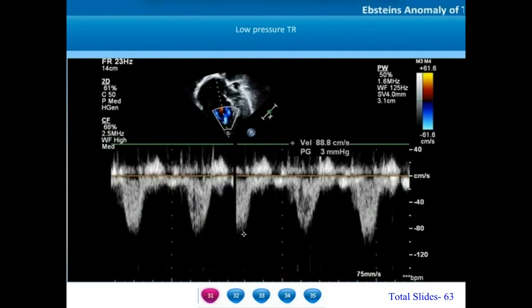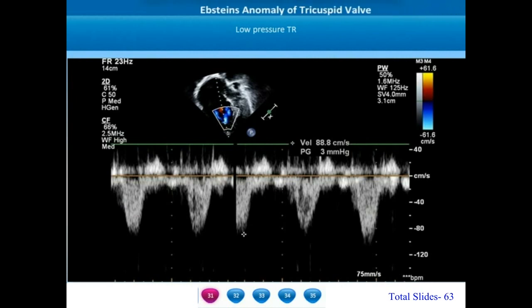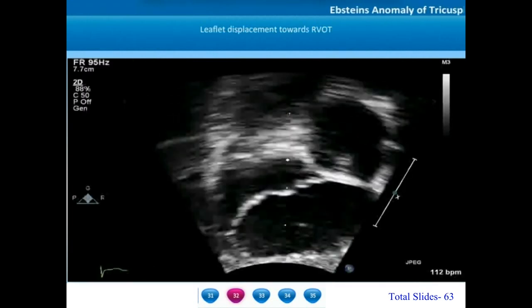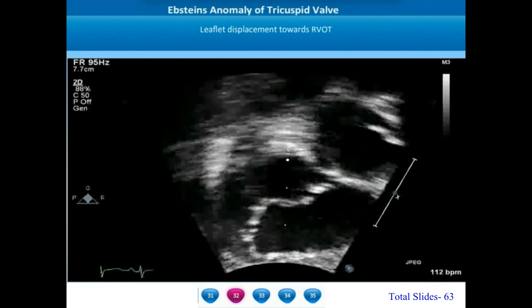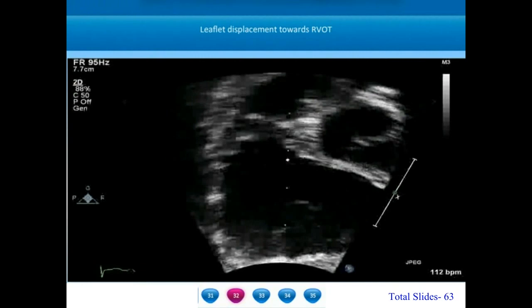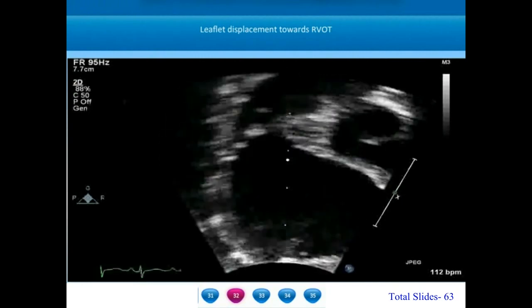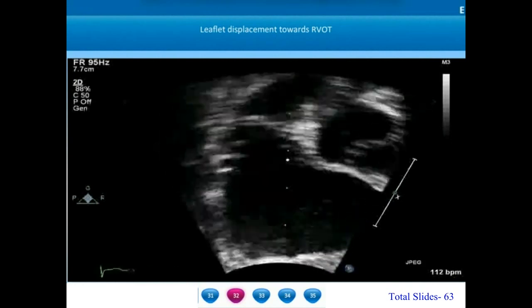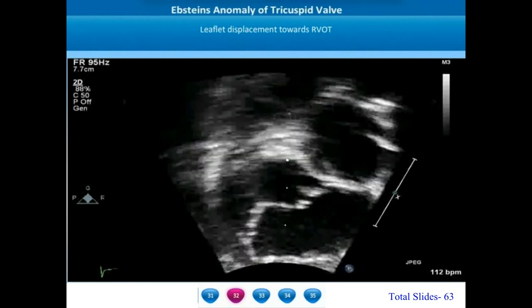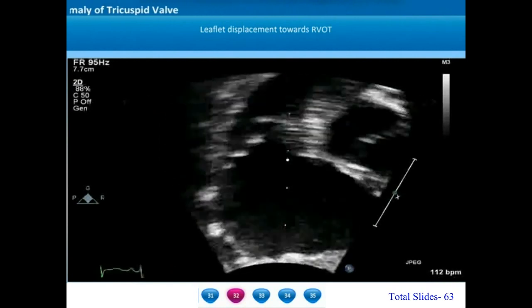In most cases of Epstein's anomaly of the tricuspid valve, the right ventricular systolic pressure and pulmonary artery systolic pressure are very low, resulting in a very low pressure tricuspid regurgitation jet. We can appreciate a TR jet of only 1 meter per second in this instance. One peculiar abnormality in Epstein's anomaly is the displacement of the leaflets towards the right ventricular outflow tract. On this subcostal short axis view, the orifice of the tricuspid valve is directed towards the RVOT and the infundibulum, and this feature is important to recognize.